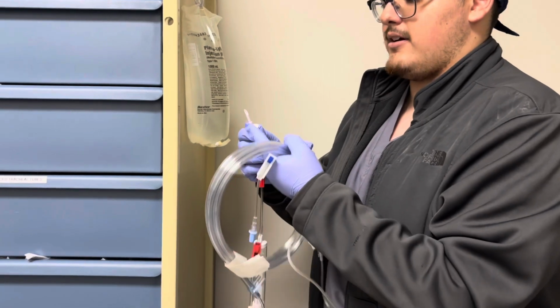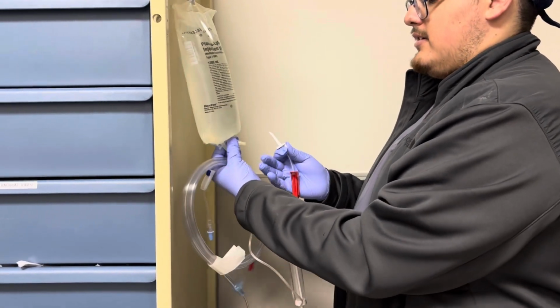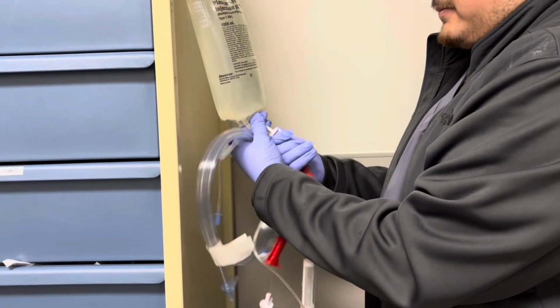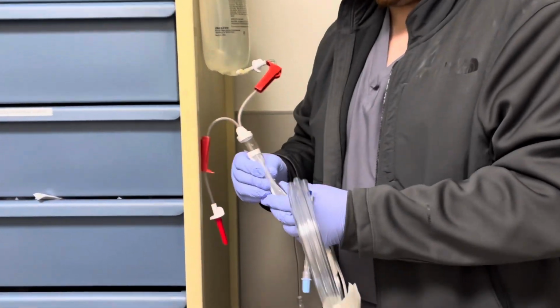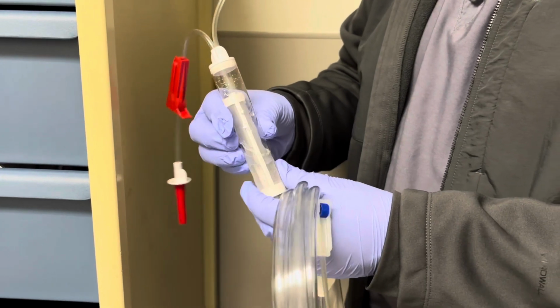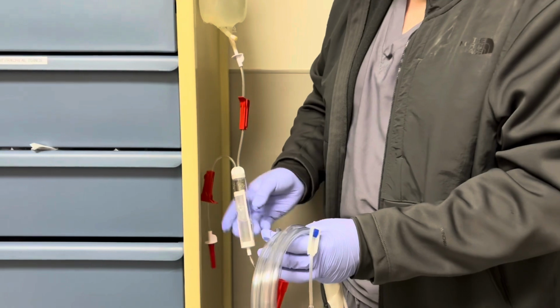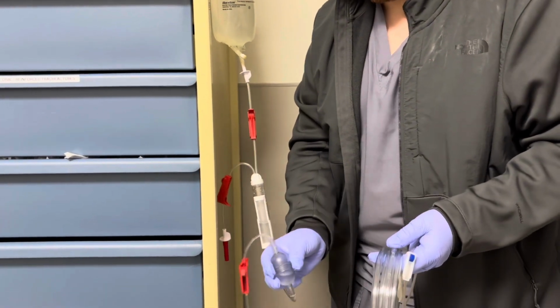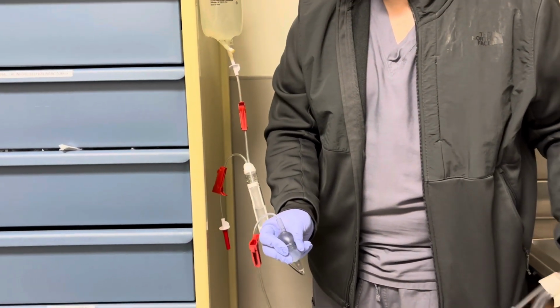When you take the cap off, that'll be sterile technique. Take this blue tip off. Go ahead and spike it just like anything else. Okay, then we have our filter here. We'll give that a couple pumps to fill it up. To about right there is fine. We'll take our pump, go ahead and flip that upside down. We'll give it some squeezes so that it'll fill up with fluid.